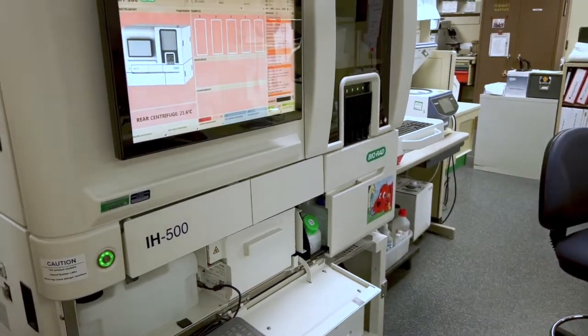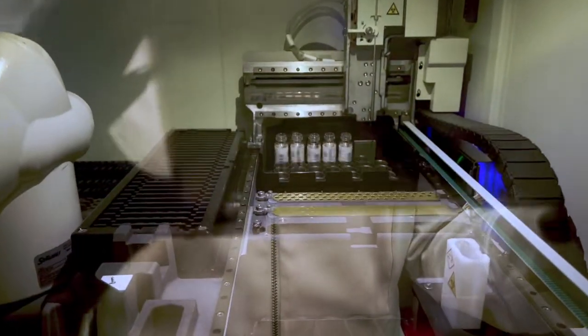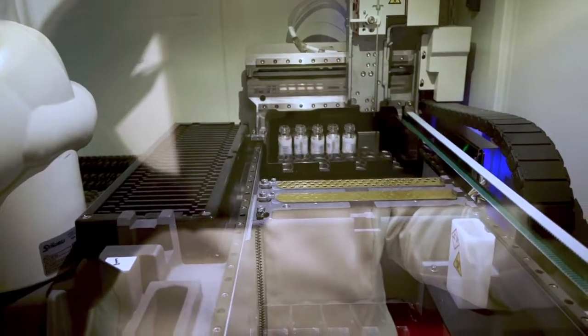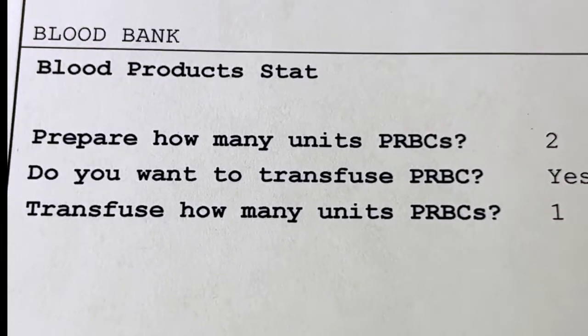This night I was working in blood bank. This hospital has the IH500, aka Clifford, and this machine will run your typing screens, antibody panels, it will do antigen typing, pretty much everything, and it's really nice to work with. So here was my very first order of the night.